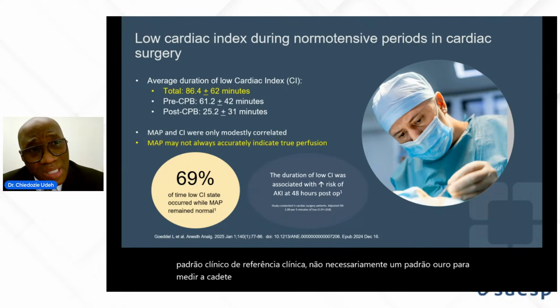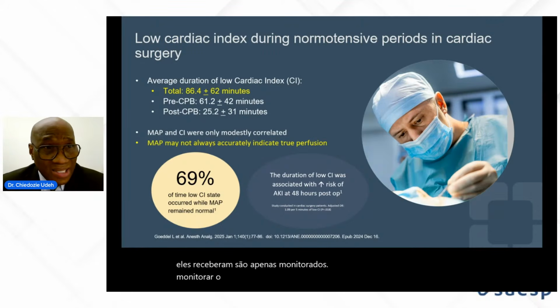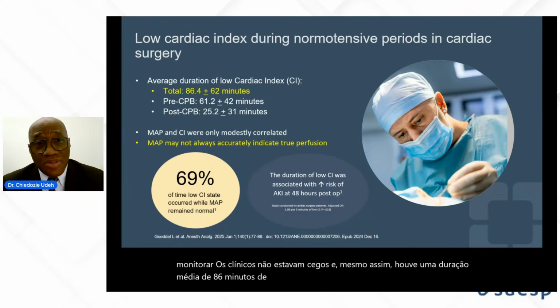So during this study, these patients had TEE, they had the Argos monitor. So they were being monitored. The clinicians were not blinded. And yet there was an average duration of 86 minutes of low cardiac index throughout the entire case.